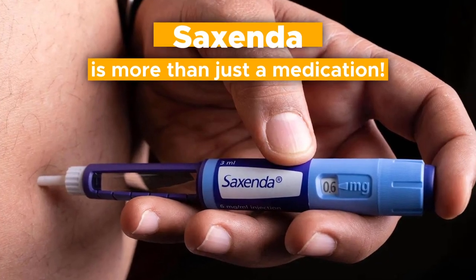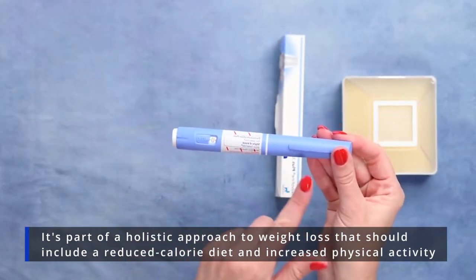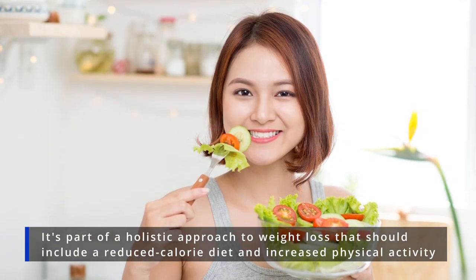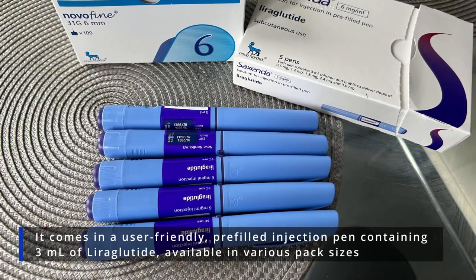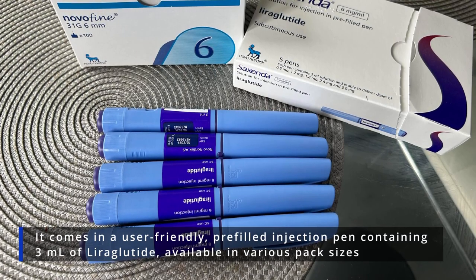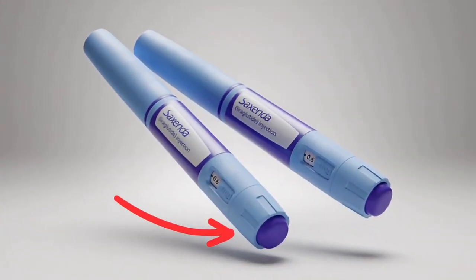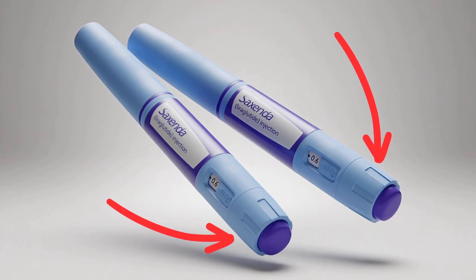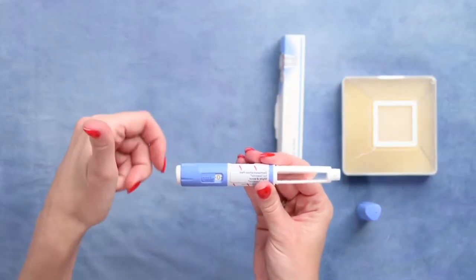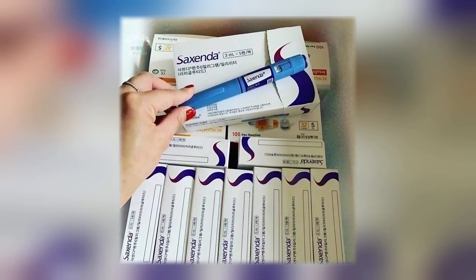It's important to note that Saxenda is more than just a medication. It's part of a holistic approach to weight loss that should include a reduced calorie diet and increased physical activity. Saxenda is delivered through a subcutaneous injection. It comes in a user-friendly, pre-filled injection pen containing 3ml of liraglutide, available in various pack sizes. Each pen is equipped with a precise dosage knob for accurate medication dosing as per your doctor's prescription — and the process of using it is quite simple.